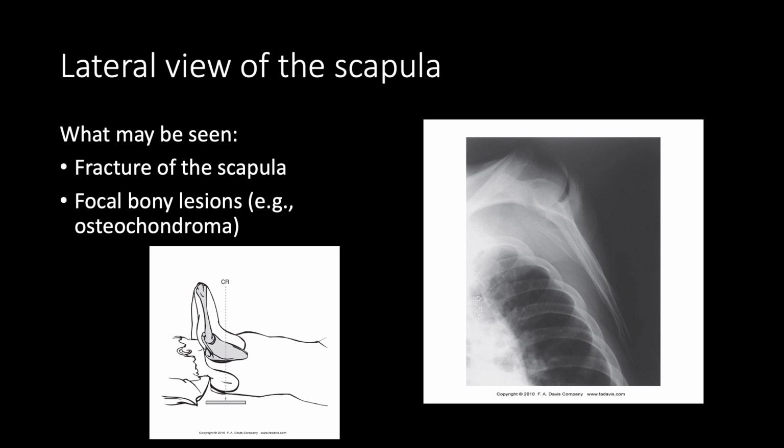All right, that concludes the shoulder basic views. So next we'll move on to the elbow.